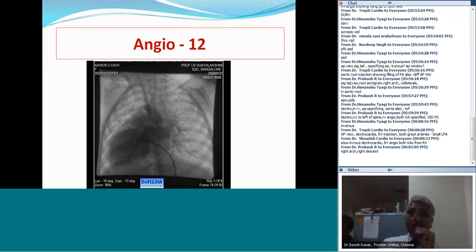No, Deep, you are way off the mark. Yes, Vimala Rani, you can be a little more specific. And Himanshu, get out of this habit of starting with dextrocardia and then looking at the situs. Because your diagnosis is partly correct, but that's not enough. You must start by looking at the situs. Himanshu, notice the situs.